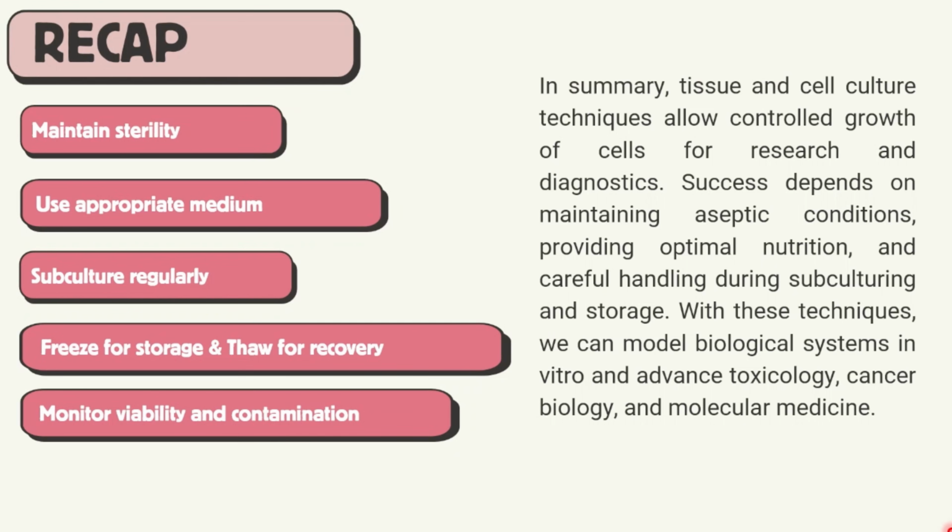In summary, tissue and cell culture technique allows controlled growth of cells for research and diagnostics, and its success depends on observing all of these things that we have recapped. With this technique, we can model biological systems in vitro and advance toxicology, cancer biology, and molecular medicine.